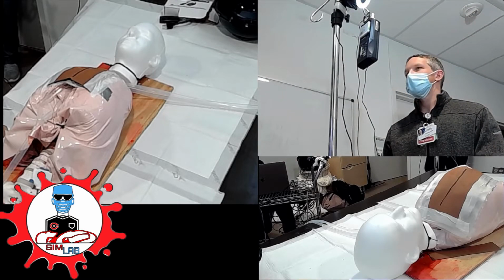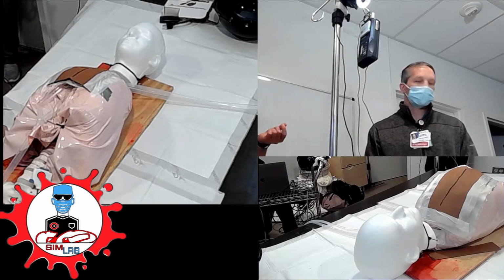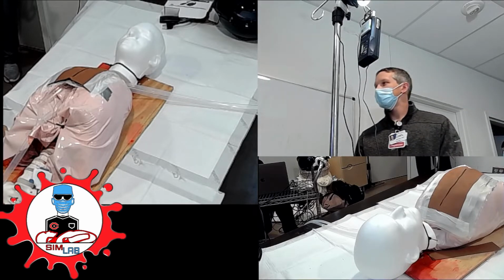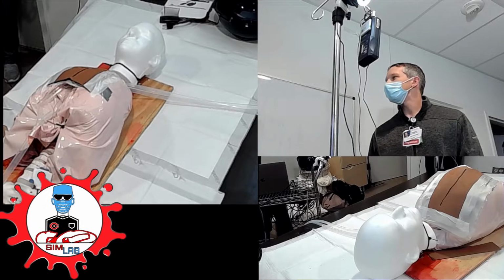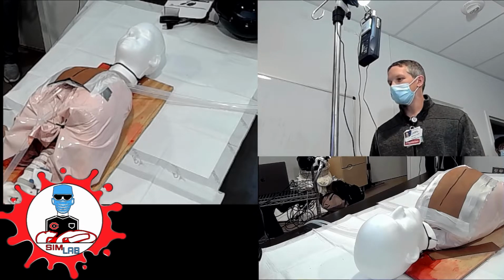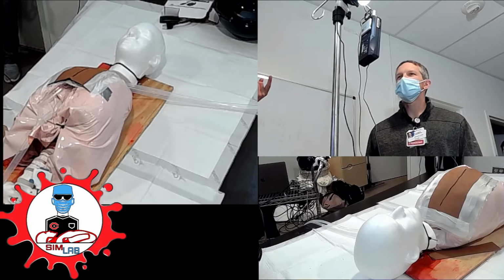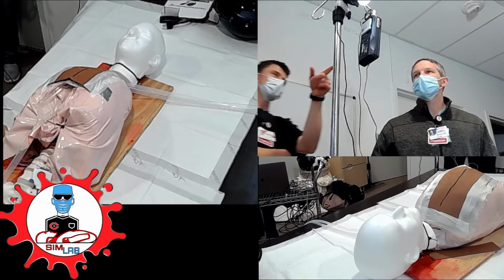Yeah, exactly. So what happens with these leads over time, and we're talking about medium stuff, but over time, these leads tend to get essentially corrosion on them, and so it's harder and harder for them to get captured. They're temporary wires, right? So one thing you can do is go up on your milliamps. But the easiest way, and the way you should do in an emergency, is hit this button.